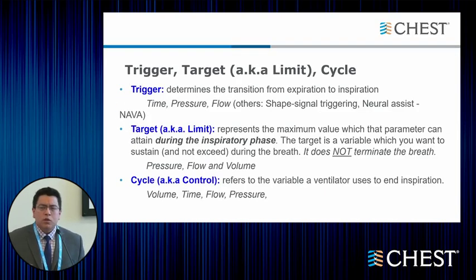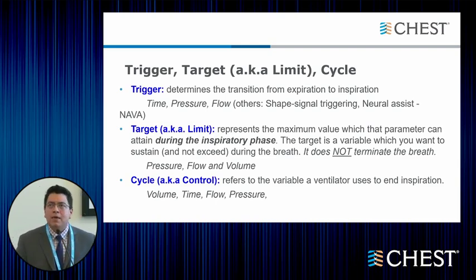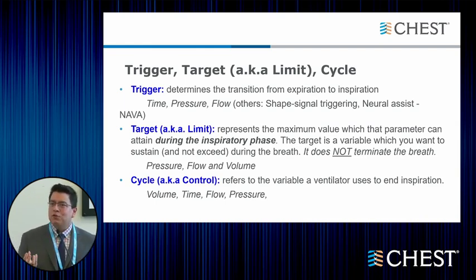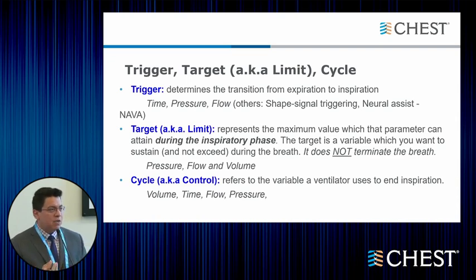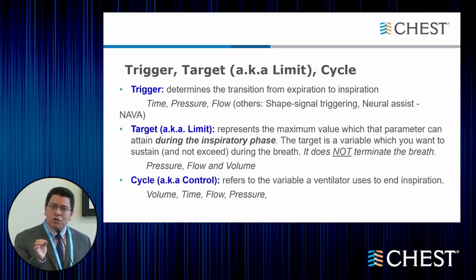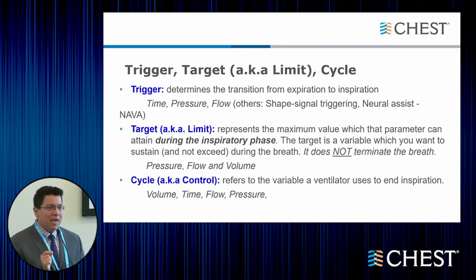And this is what we are seeing here when the patient is active and the different changes in the pleural pressure. So with those concepts in mind, and I'm sorry that it is kind of a heavy portion of the talk at the beginning, but it's really important to discuss those topics to actually move forward with what we call the trilogy of the mechanical breath in patients that are mechanically ventilated. And that is the trigger, the target, and the cycle. We have probably heard this a lot of times, and we try to describe the modes using this three-item nomenclature. But it's actually, again, very simple. So the trigger is that variable that the patient is going to overcome in order to trigger the ventilator to deliver a mechanical breath.